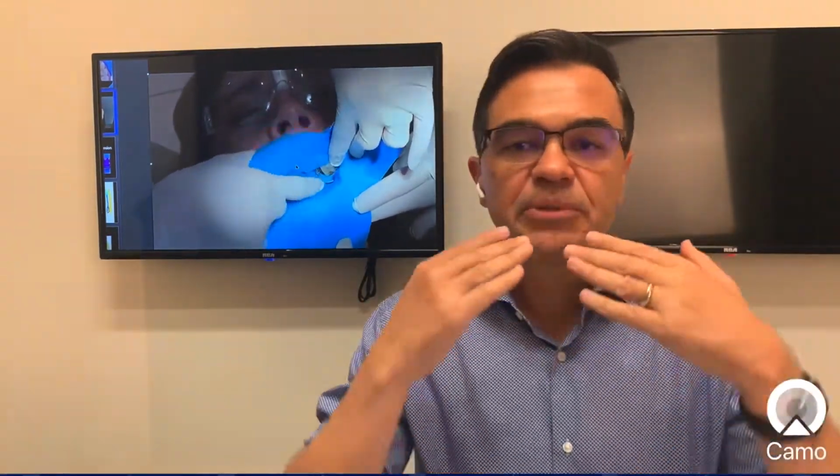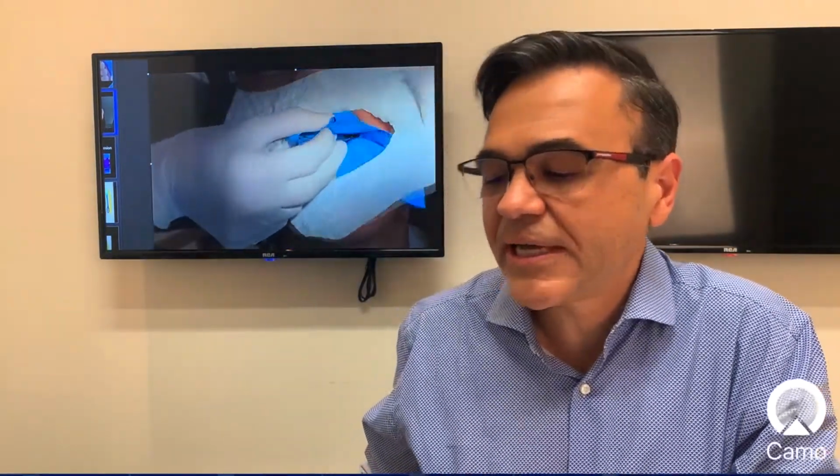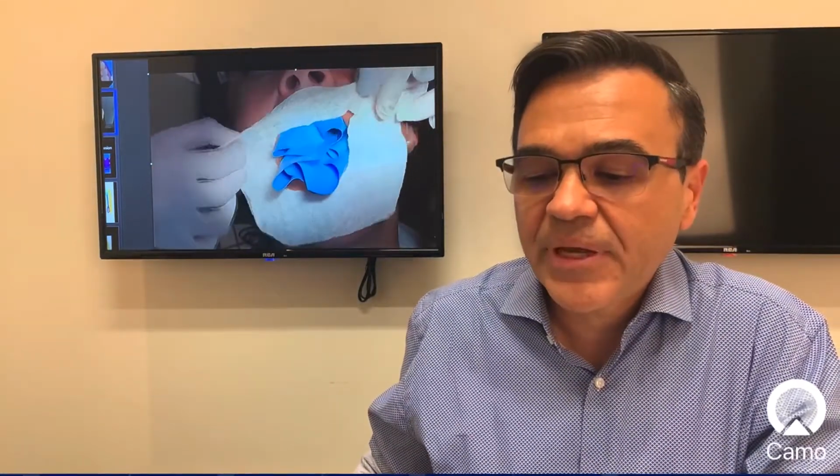And you know what I do in the posterior? Then I close it with putty in the palate so that I will get total isolation. But I'll have a great area where I can work. And it's amazing the amount of isolation that you can get with an open or split dam technique. But as I'm showing here, you can always close the back of your palate with putty. And that gives you total isolation, Jazz.